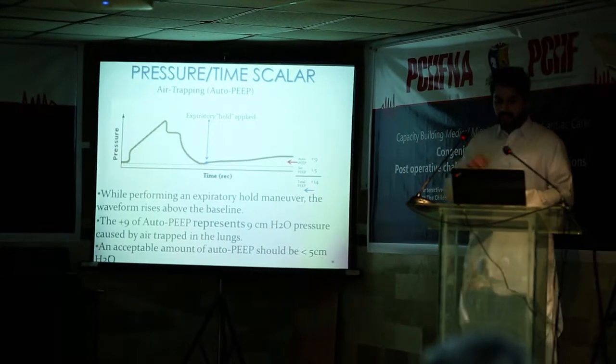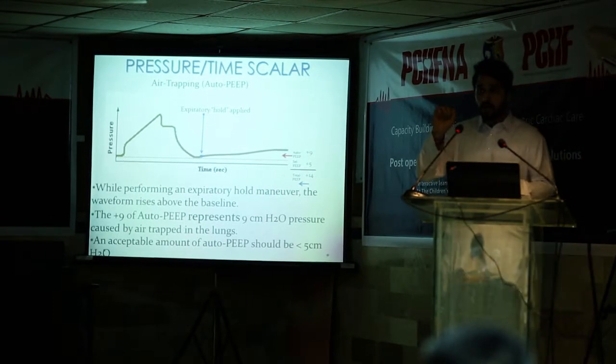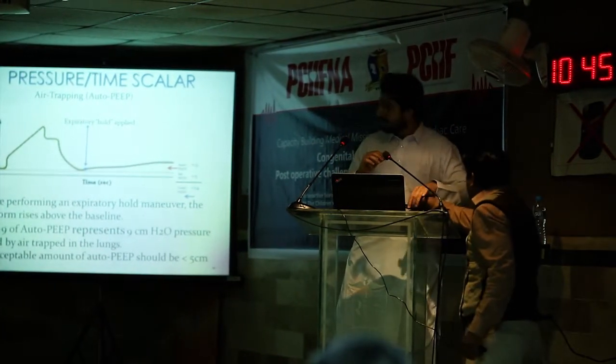As you said, we have something in the ventilator called expiratory hold. This is a button. When you press it, you will cause a hold after the expiration.